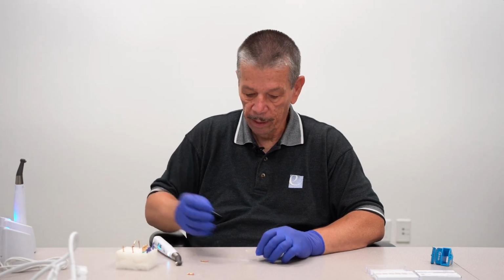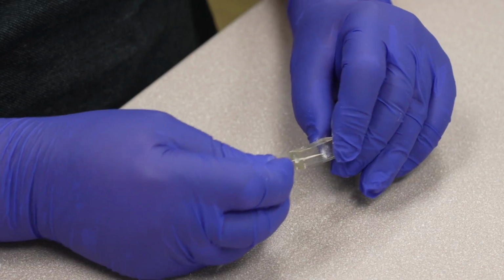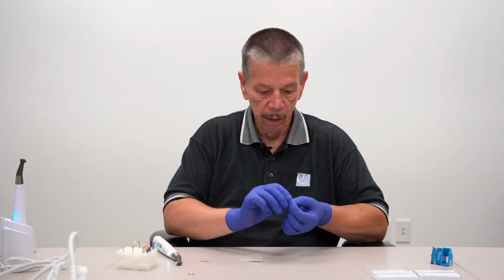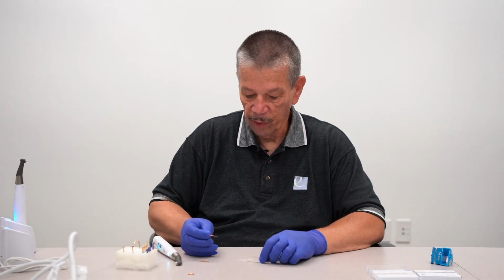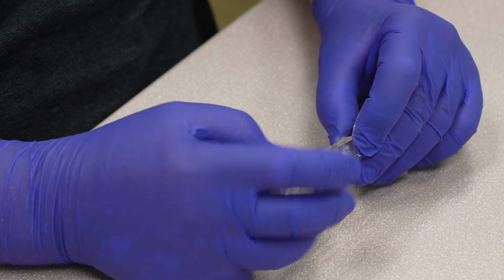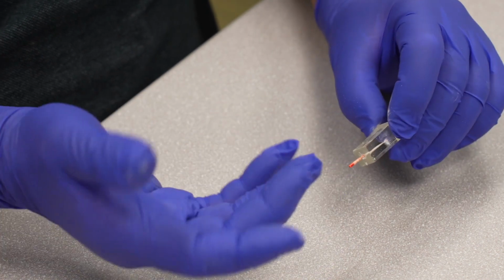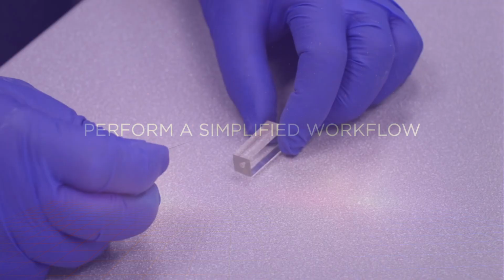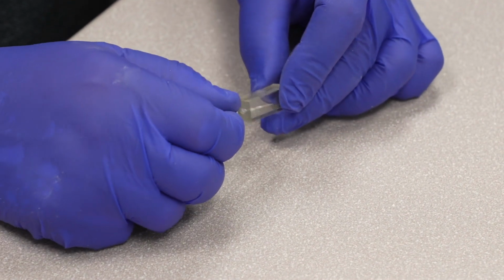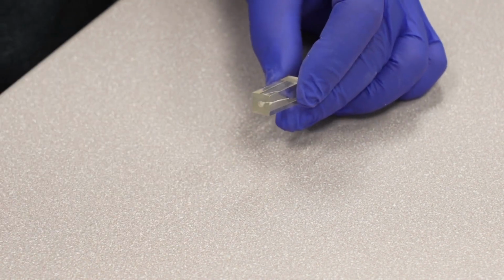And again, we can negotiate, and we're going to take, this was an 0625 primary file, we take our 0625 gutta percha, goes to working length. Negotiate with a size 10 stainless steel file. There we go.